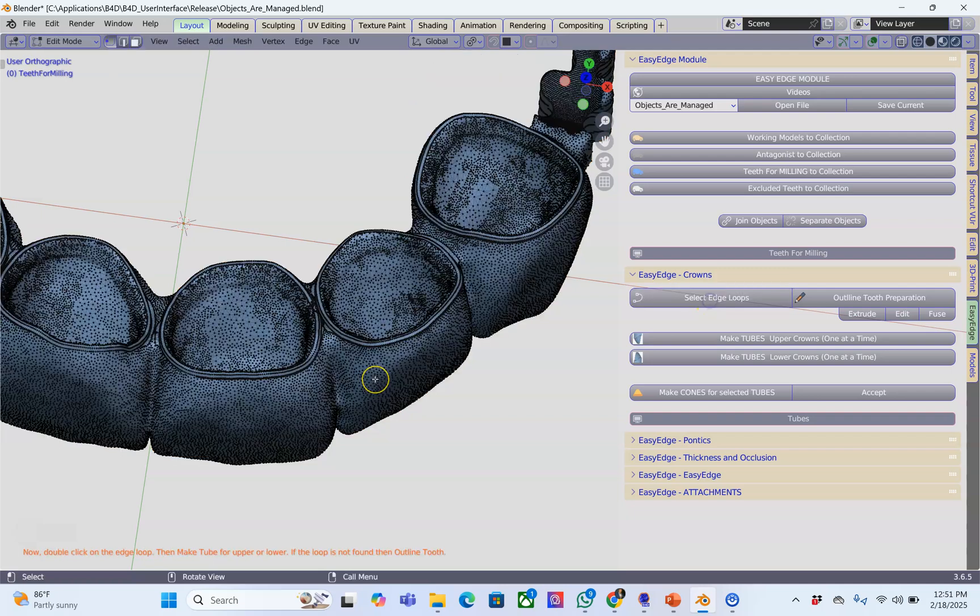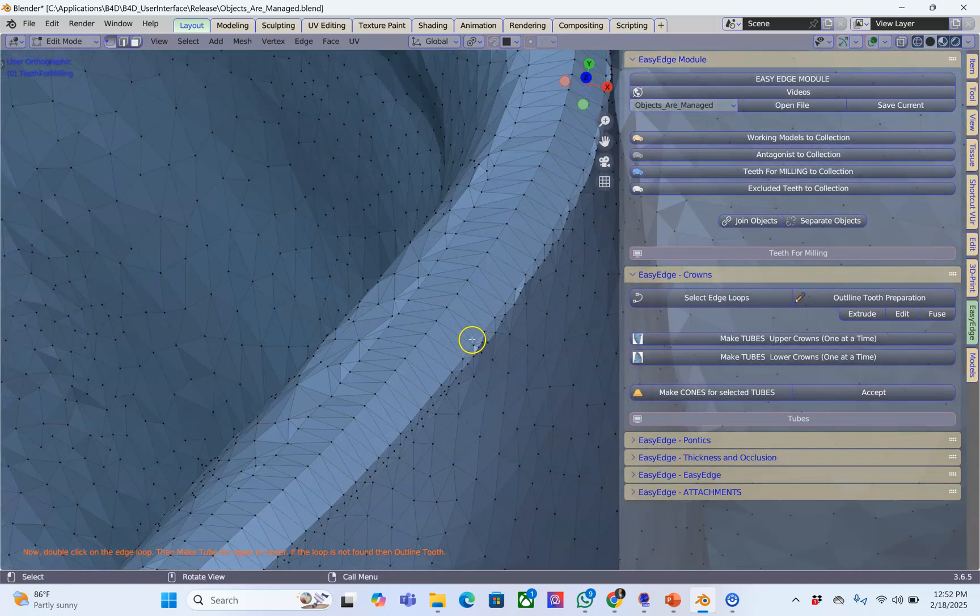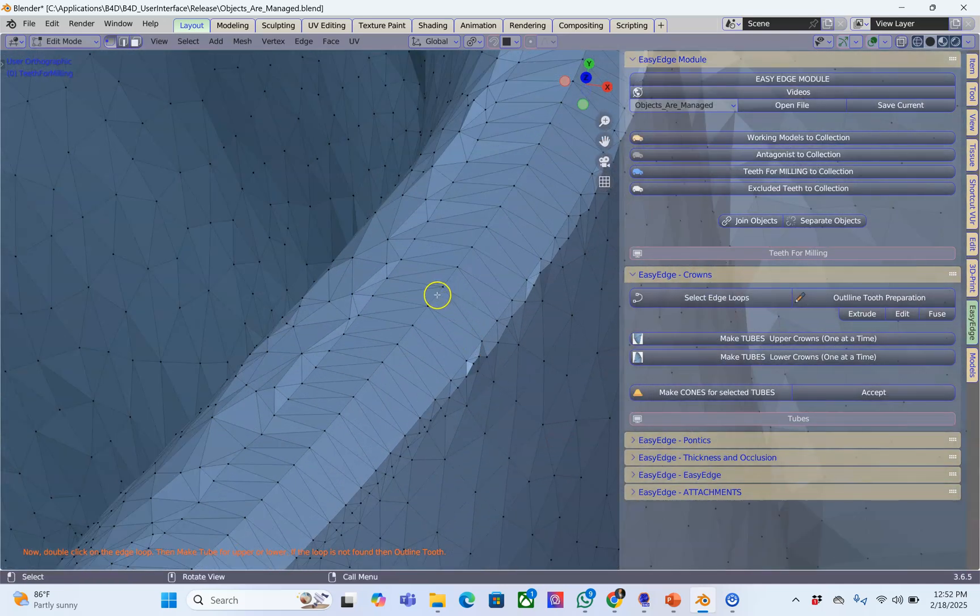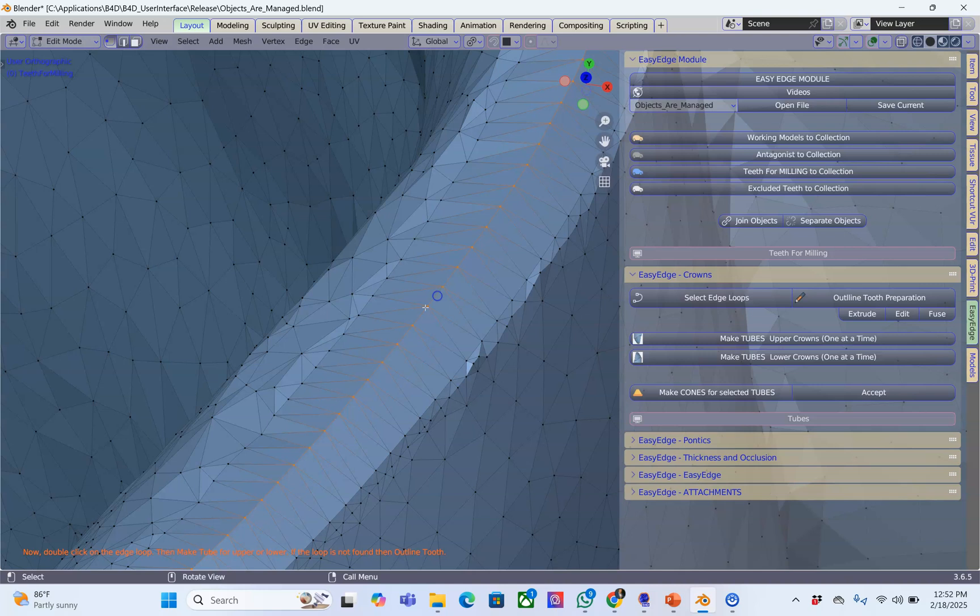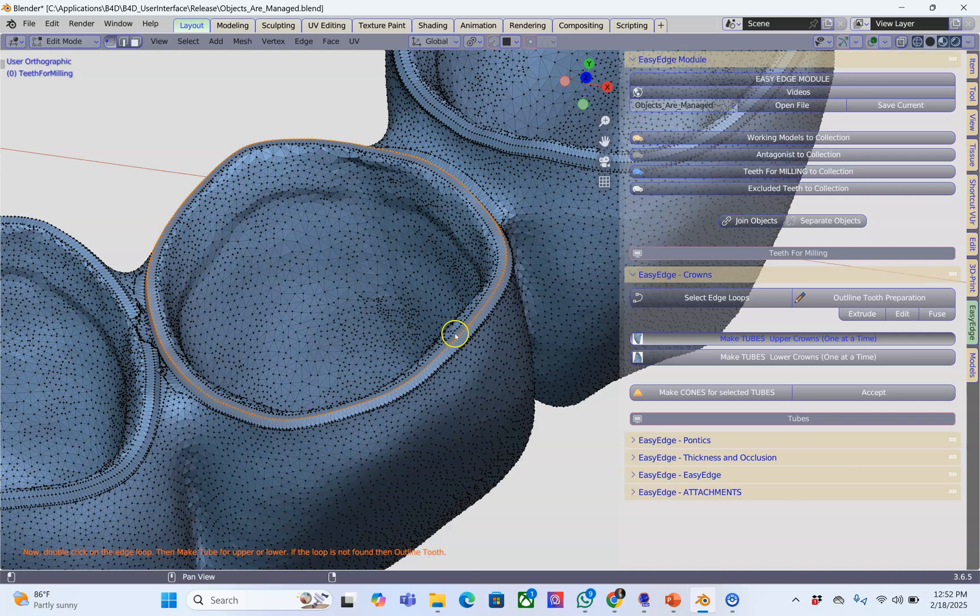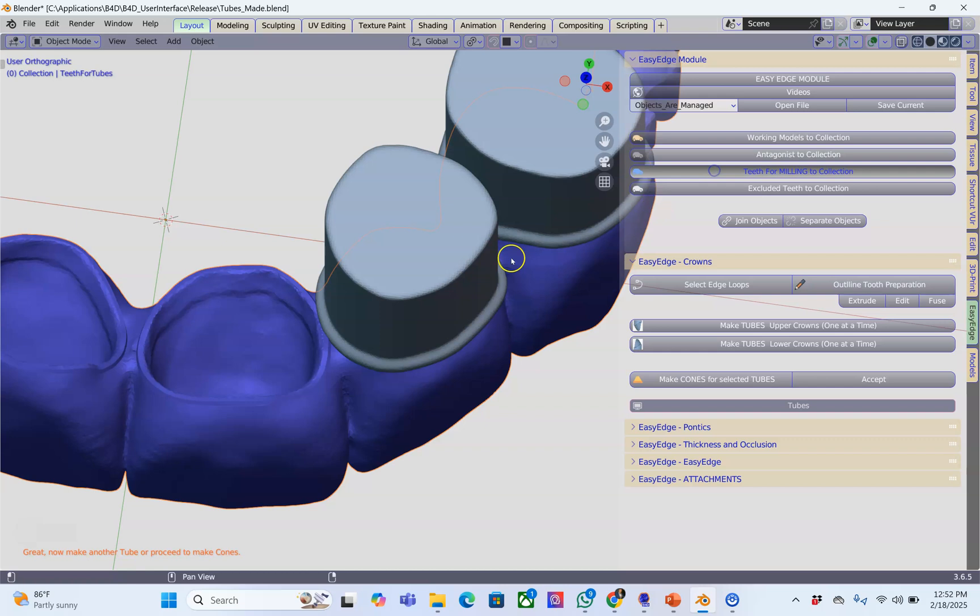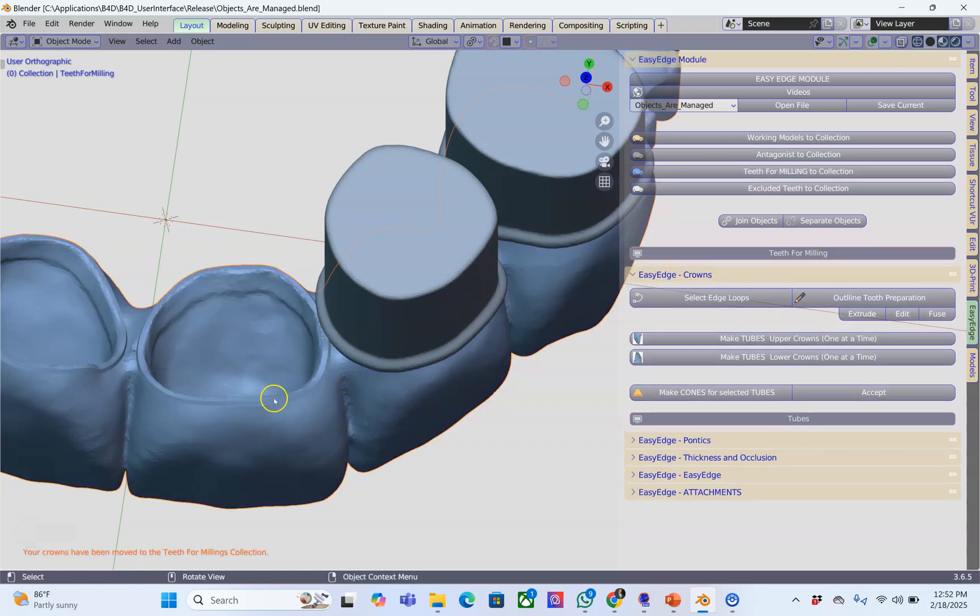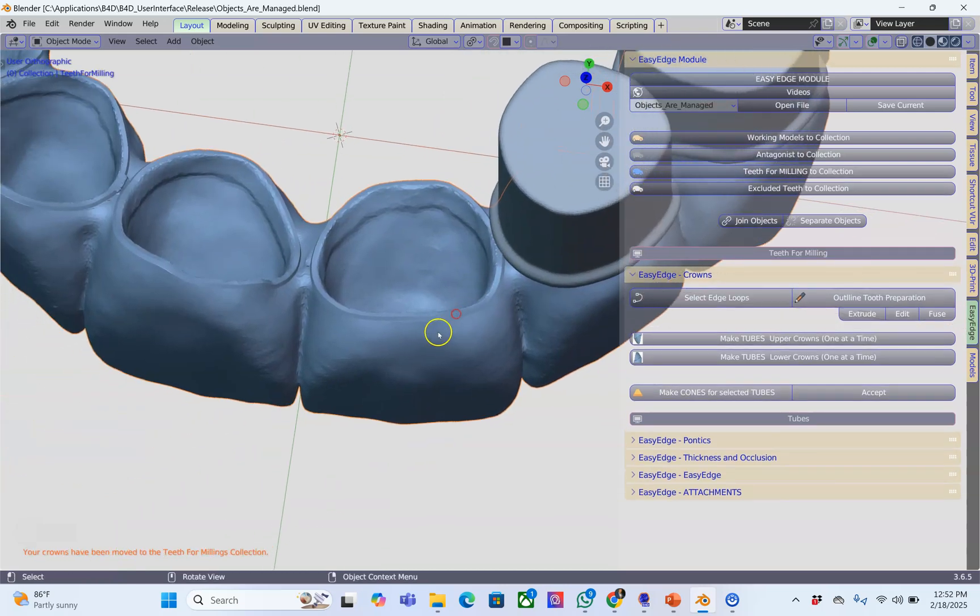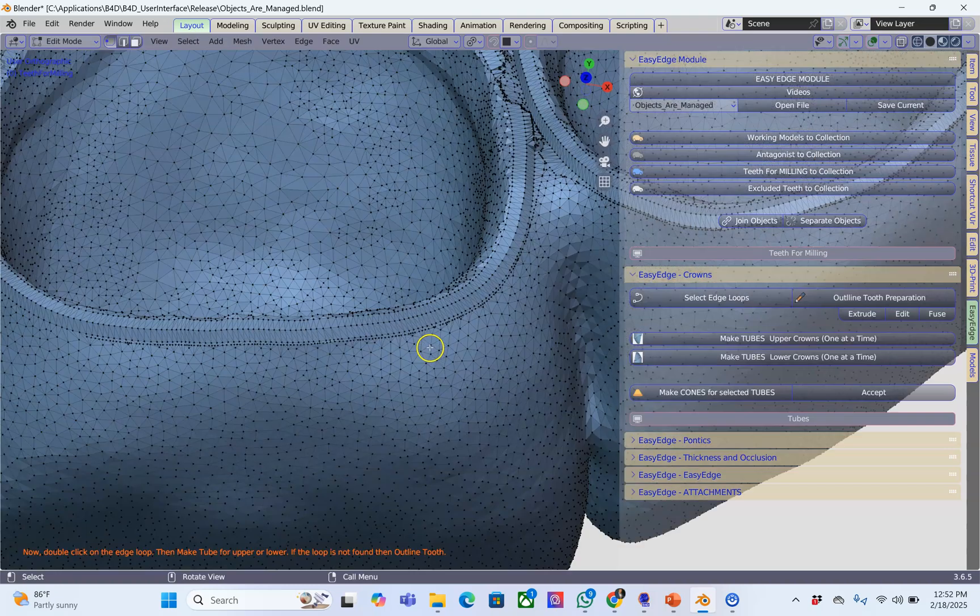Select edge loops, zoom in, double click on the edge, make sure it goes all the way around and then make a tube. I'm going to do this for each one of them. This is looking good. Select it, put it back into the collection. This is very important, don't forget it. It needs to be a lighter blue in color.